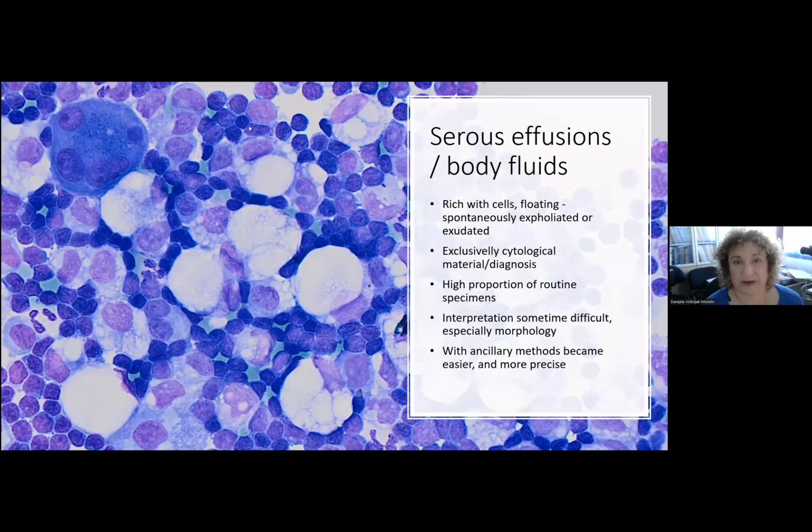So what about serous effusions or body fluids? Any serous effusions that we look at are rich with cells. Cells are floating. They spontaneously exfoliate or exudate into this fluid. And this is exclusively cytological material and cytological diagnosis. This is why I love it so much.